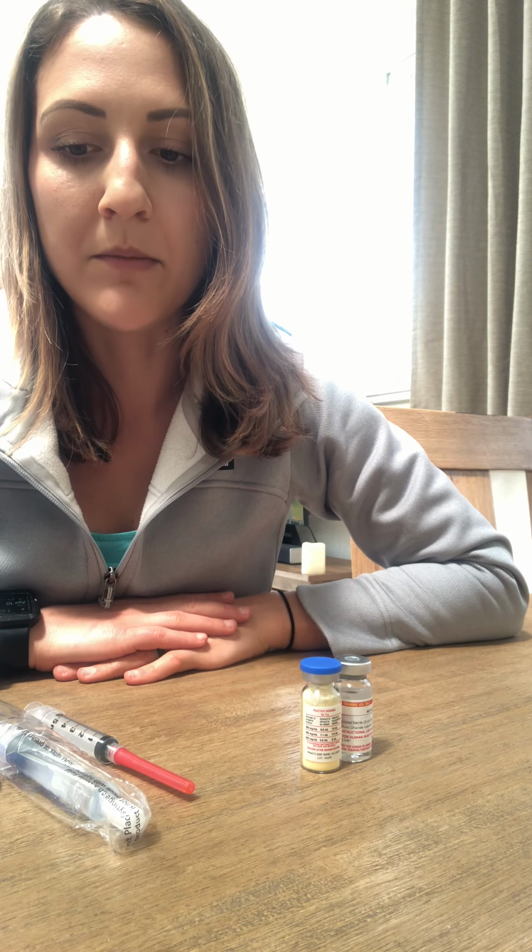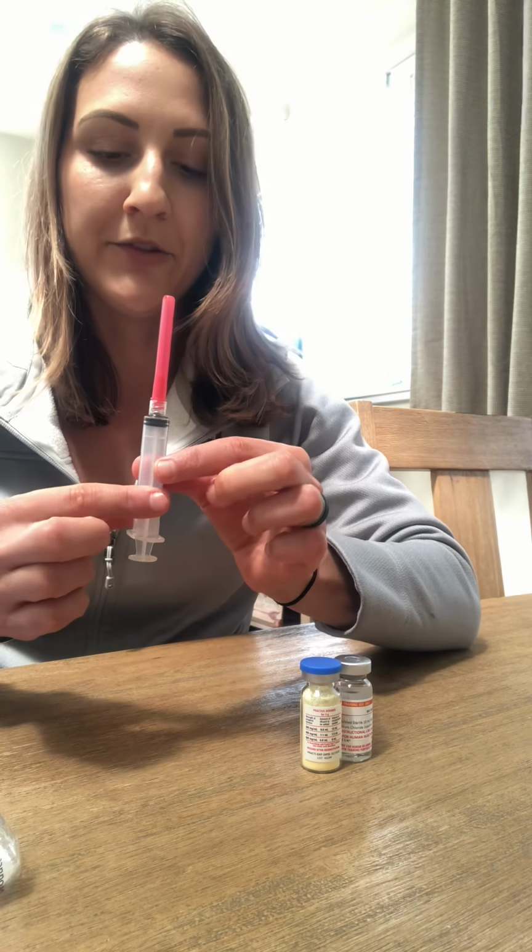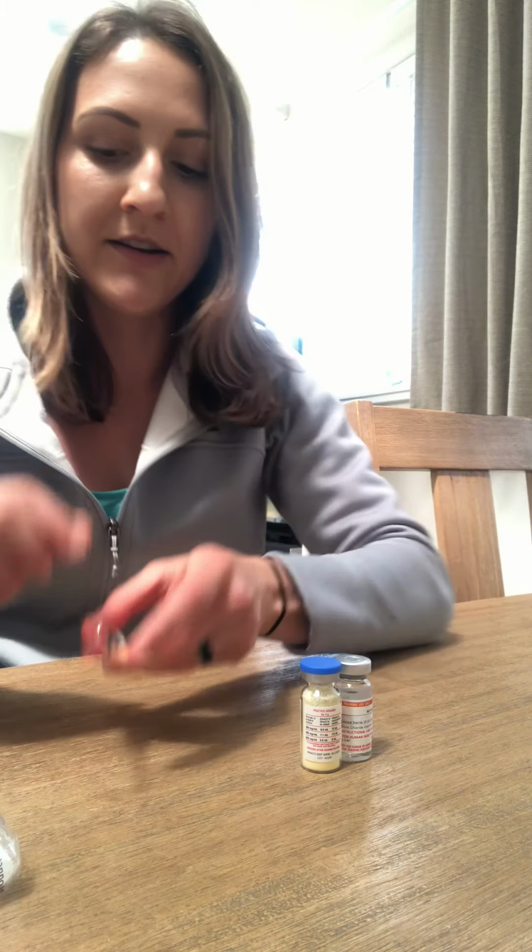And then I will be assessing the patient's IV site. I'm going to be looking for any signs of infiltration, or if the IV line tubing is kinked, or I just want to make sure that it's patent. Then I'm going to be reconstituting my medication to get it ready. So I'll have my blunt needle syringe. I'm going to tighten the lid on there. And then moving to the reconstitution part of the administration.